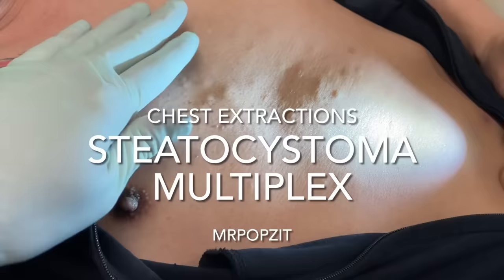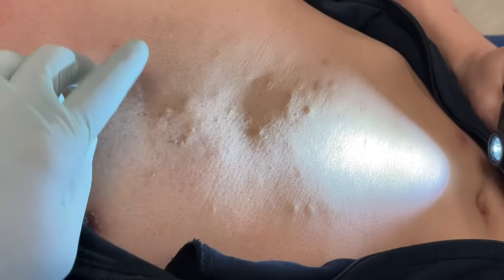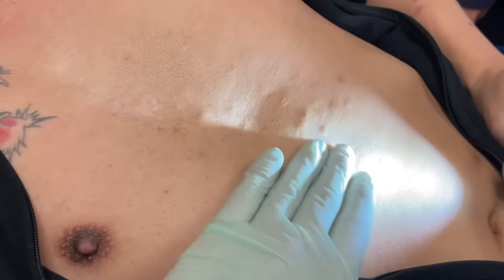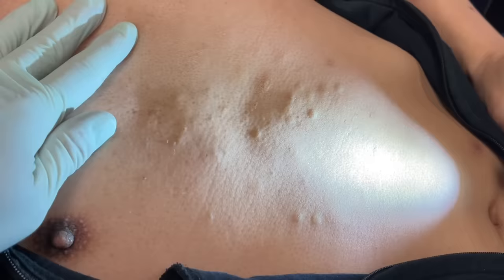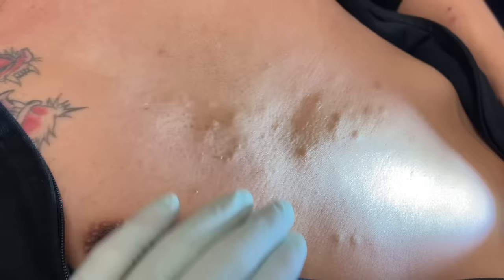Okay guys, this is Steatocystoma Multiplex — very common. You can see it on the chest here. Doing a little side lighting on it. We're going to mark all these and just a little tiny bleb of lidocaine and we should be able to pull these out. I would say maybe 12 to 20 of them here, some bigger and some smaller ones. We're going to go through, mark each one, put a little tiny bit of lidocaine, and then pull them out just like we did on the arm. We're always conscious of post-inflammatory pigment — we want to minimize that as much as we can. It will fade, but going into this summer, we want him to have the smallest scars possible.